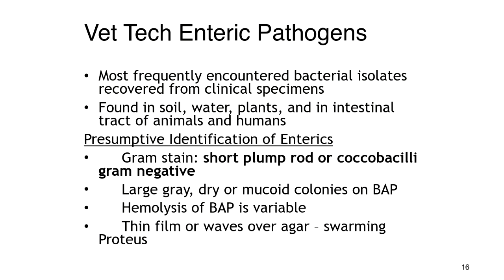Again, in your laboratory setting, if you were to see one of these, you could use the words presumptive identification or possible, suggestive of. You are not saying that, for sure, I have something, but it is presumptive, suggestive of, or possible, those kinds of words.